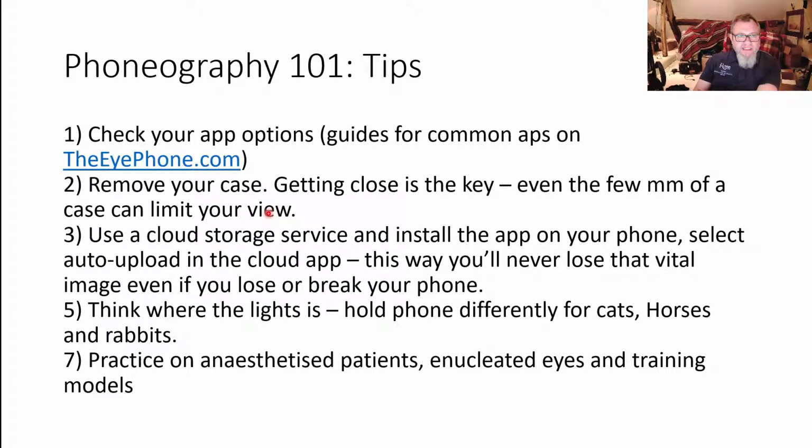So, some tips about setting up your apps and then general photography. Before we go into some more detail, let's go through the setup options for your apps. There are some guides for common apps on the website.